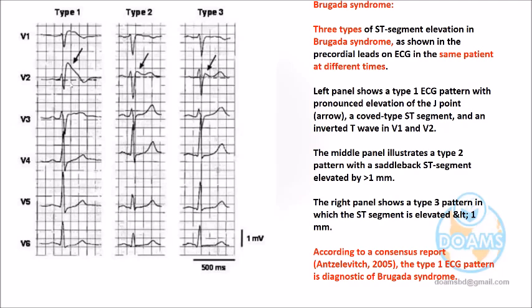Where is the Q? Q is not there. The hallmark of myocardial infarction is not there. So we are confused whether this is MI or not. But MI can also happen without Q. We previously termed non-Q MI as not full thickness damage, so Q will not be visible.